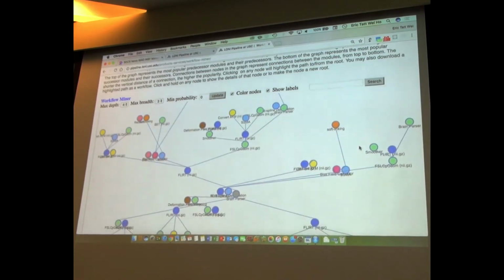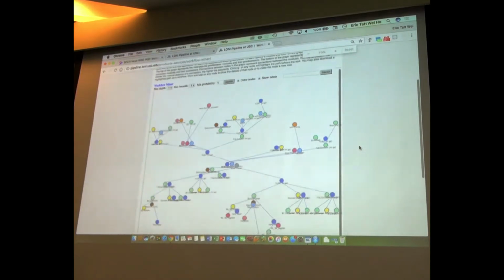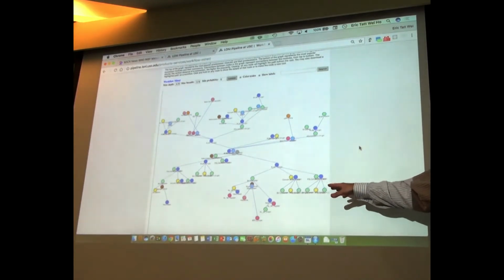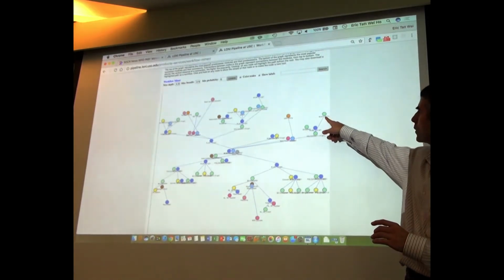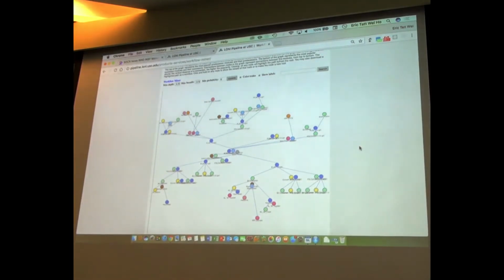So let me zoom out a little bit just to give you a little bit of perspective of what's happening. So I type segment or segmentation or something like this. So this kind of tells me various things that can talk to each other, and I can select a branch. This is a dynamic object, by the way. This is not an image, right?